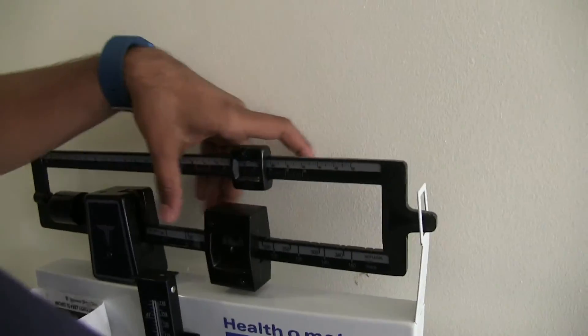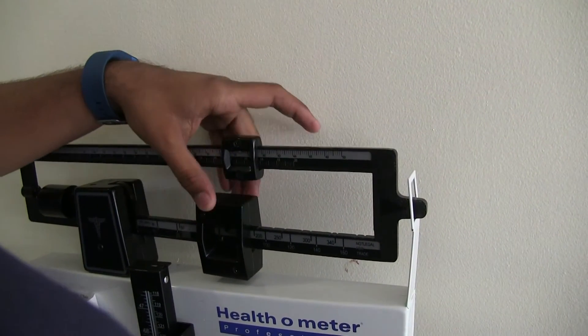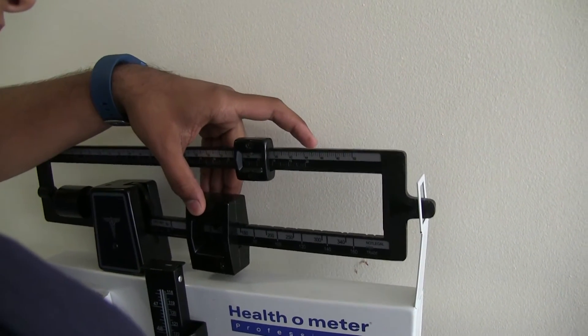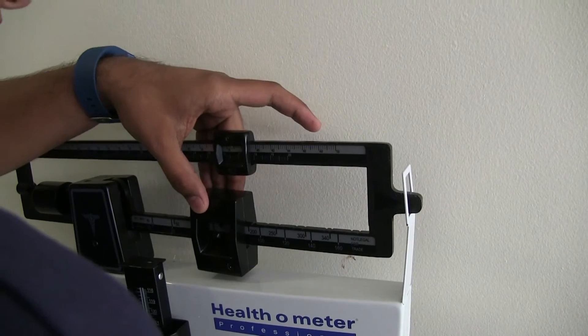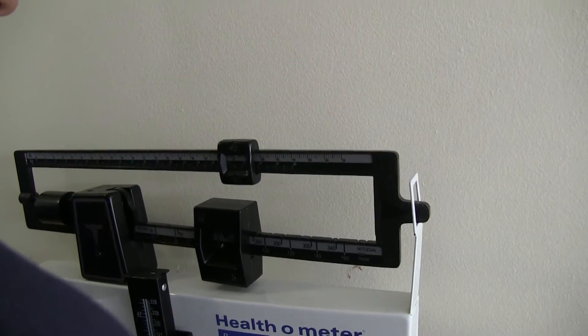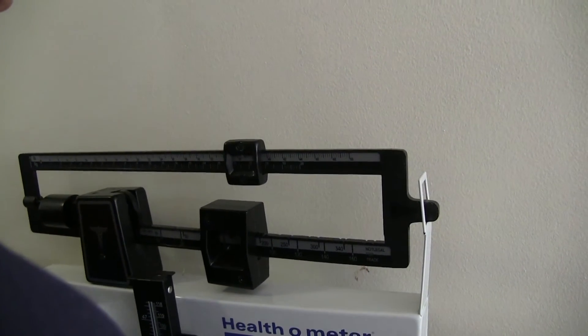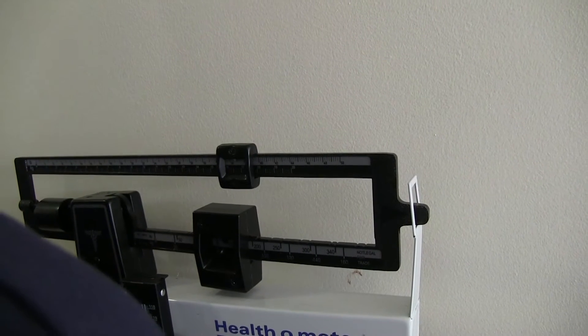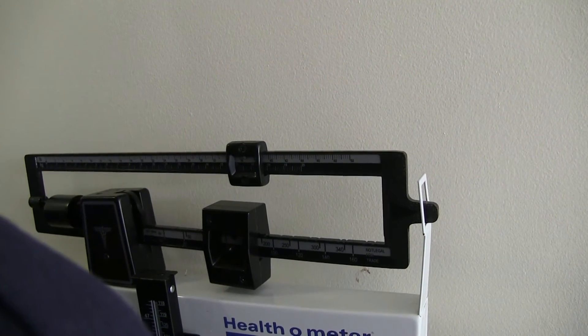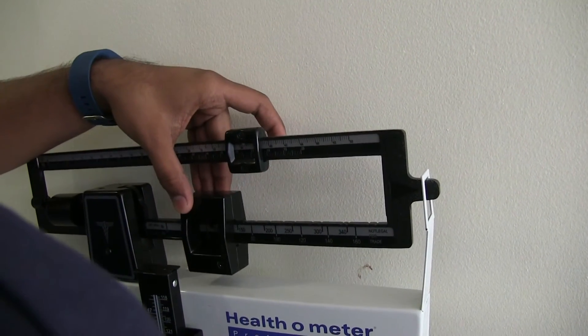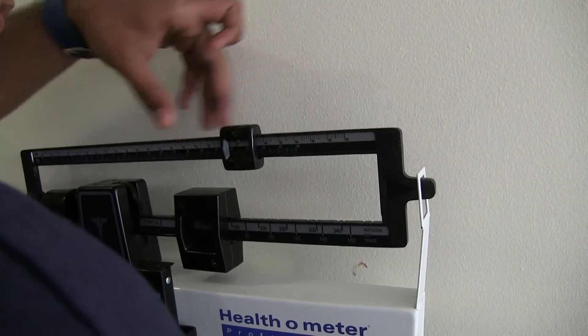And then you have, first you want to go through at the bottom and then figure out like put it at 100 or 150. If it's an older patient, what I usually like to do is look at their previous weight and then try to get the scale there, so I'm not going through the whole thing. And you can kind of approximate initially. So we'll start with over 100 here and then all the smaller digits are here.